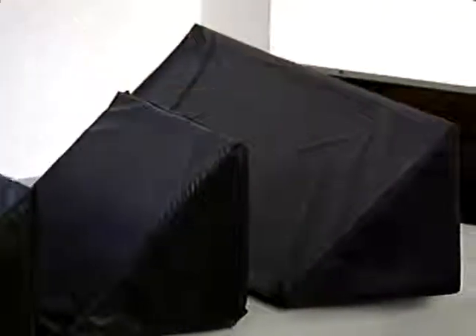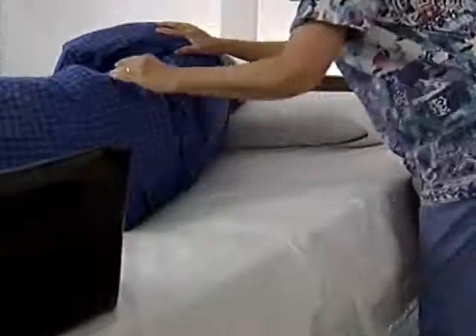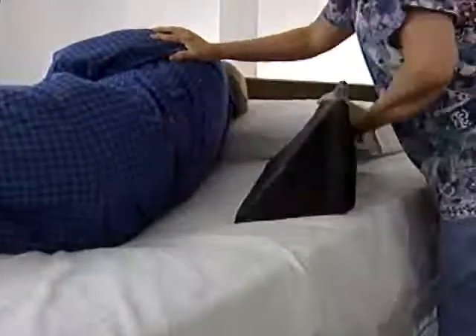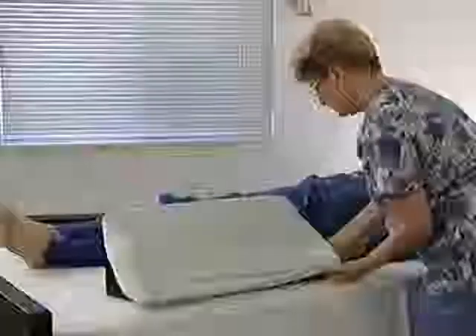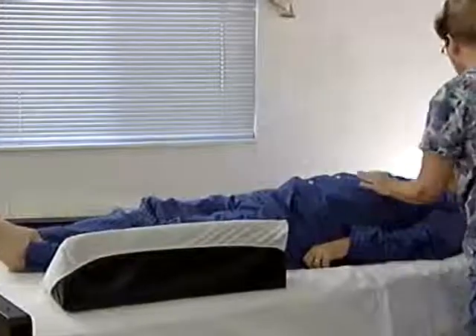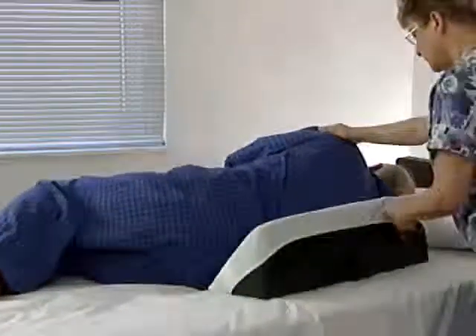And the large trunk positioner. To use the Tough Guy Trunk Positioner properly, simply roll the patient into the desired position. Place the blue side of the positioner snugly against the patient and allow the patient to rest against it. We prefer that the patient have something between his skin and the patient side of the positioner. This can be pajamas, a gown, the bottom sheet, or a cover as shown here.